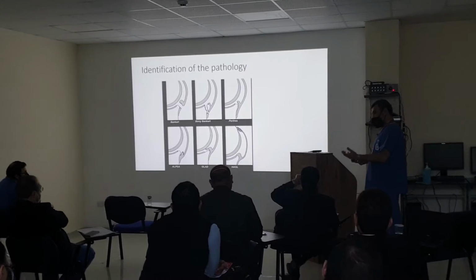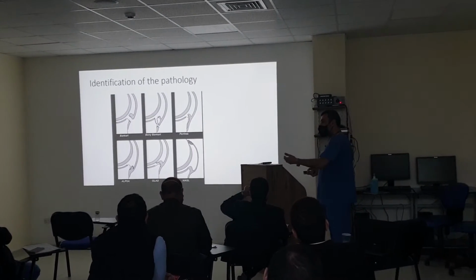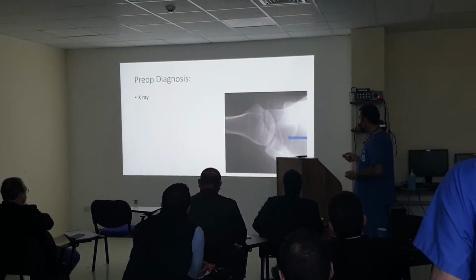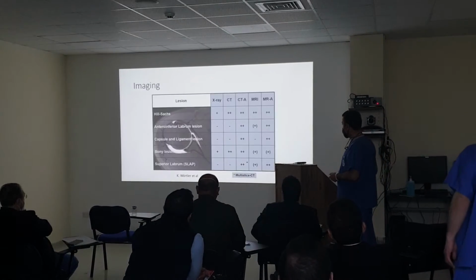So you have to know this pathoanatomy and look for it in your imaging before you do the surgery. X-ray has a limited role, but it can sometimes show the bony Bankart, or it can show the Hill-Sachs lesion.